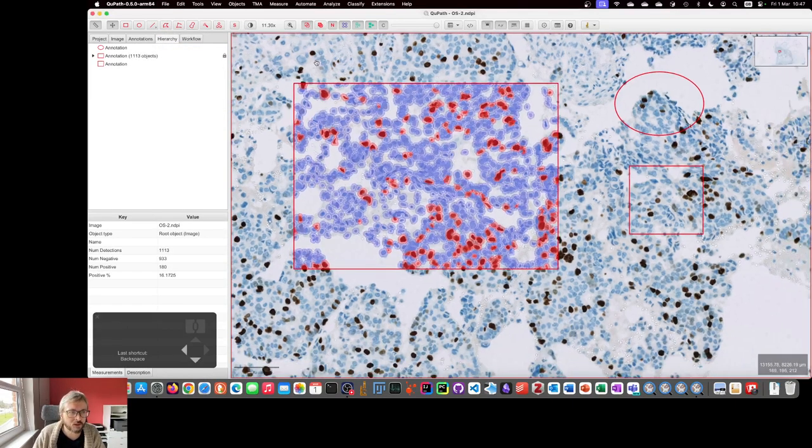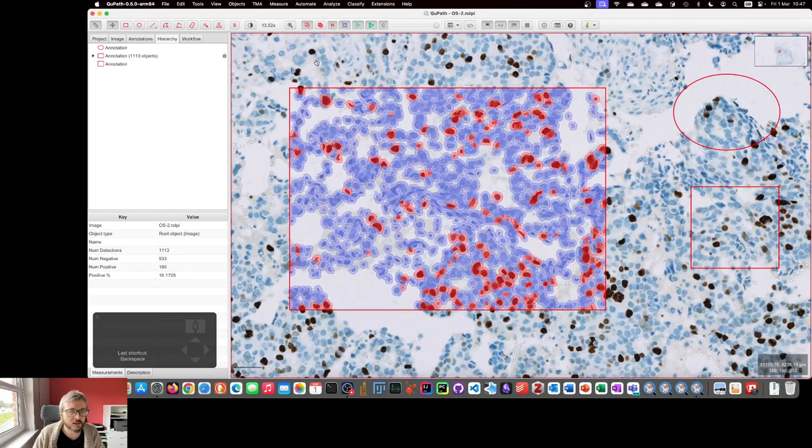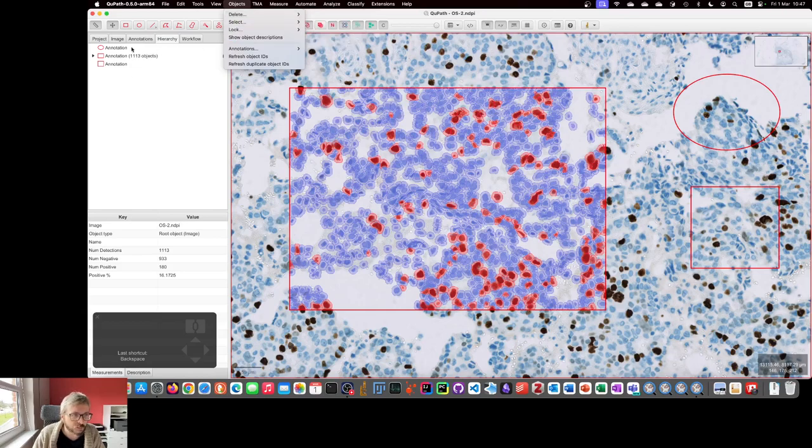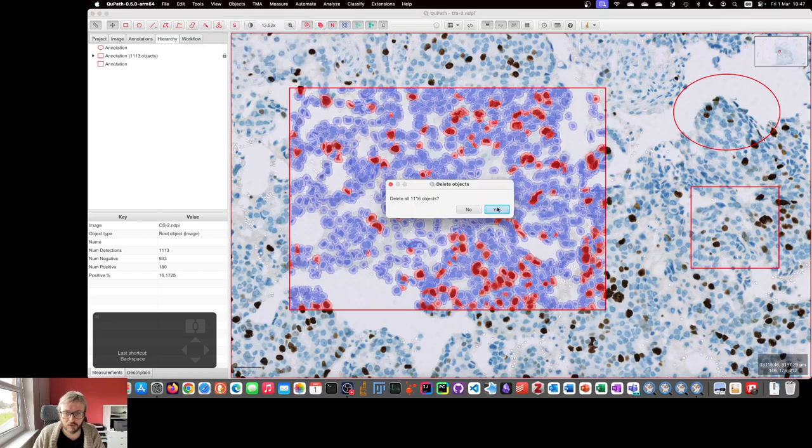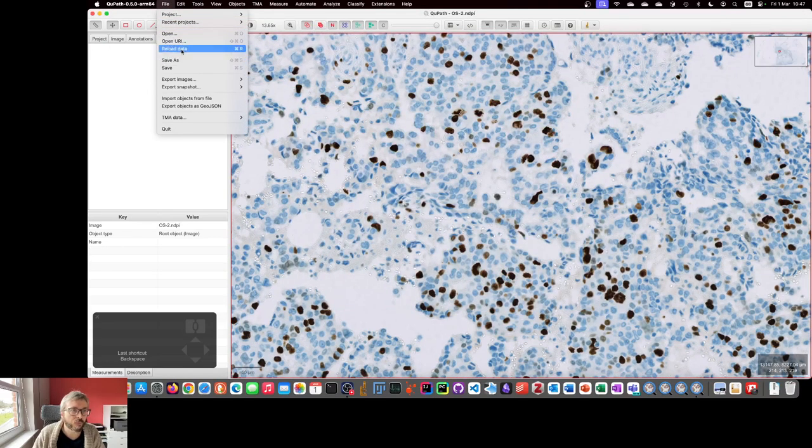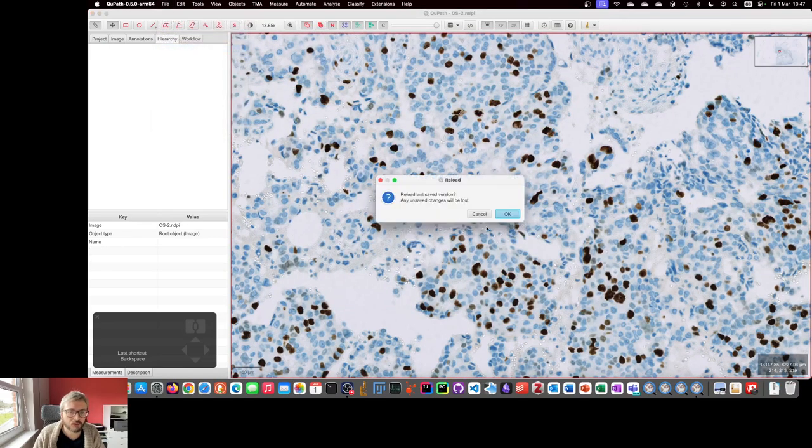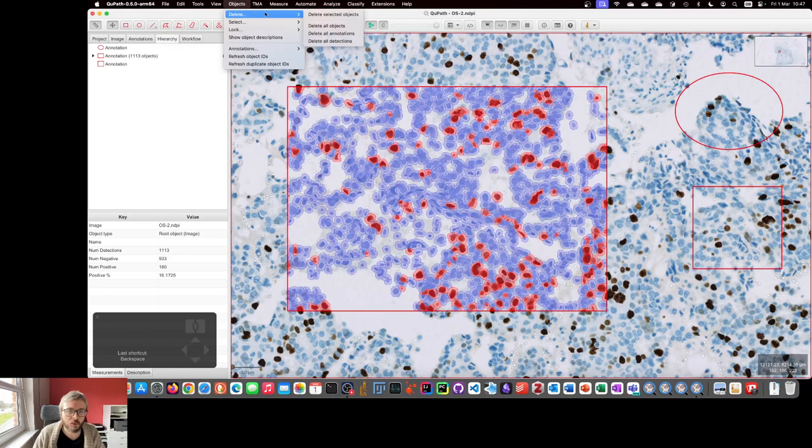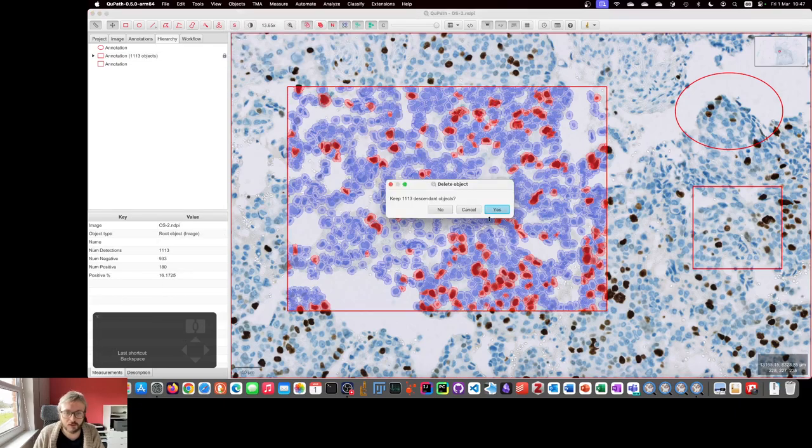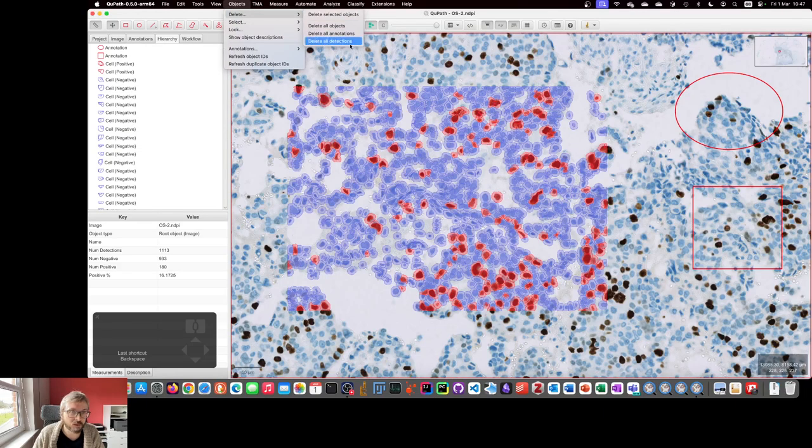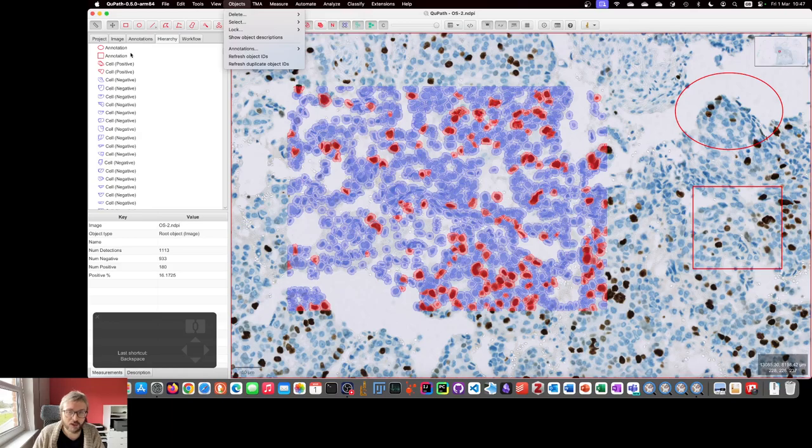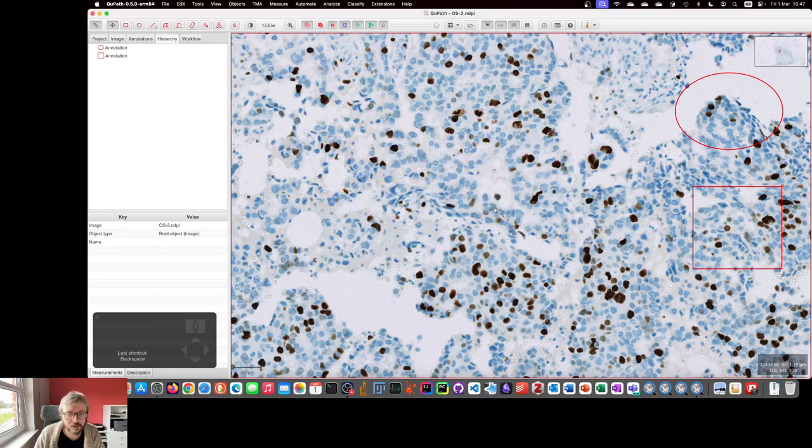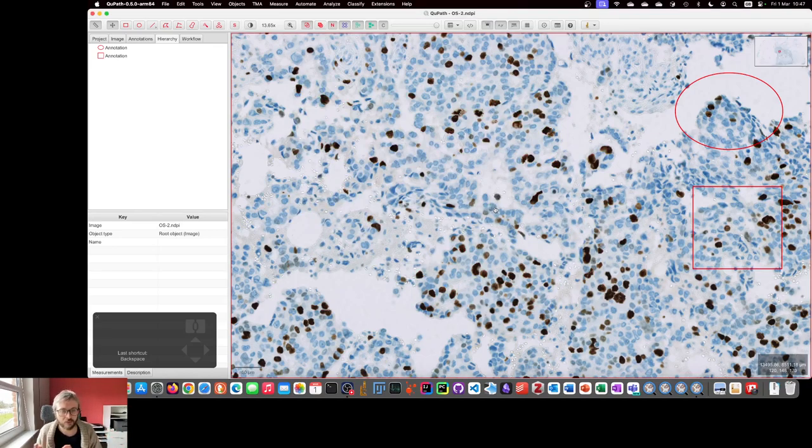Actually, I should also consider the case that you showed in the video, which is you can go to Objects, Delete, Delete All Objects. But pay attention to the annotations here, because everything will disappear if we do that. So, Delete All Objects will get rid of all of them. Let's say we reload the data, and we go to Objects. If we want to selectively delete only the cells, then they are an example of detections within QPath. So, if we delete all detections, then our remaining annotations should remain, and just the cells should go. So, that's a slightly... Probably in this case... If you want to keep the annotations that are there, but only get rid of the cells, Delete All Detections is a way to do that.